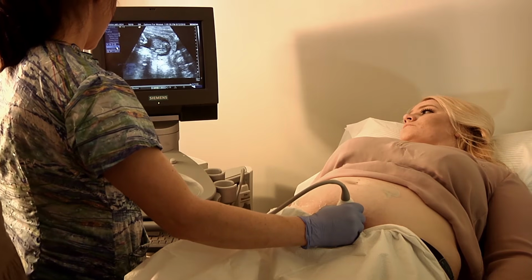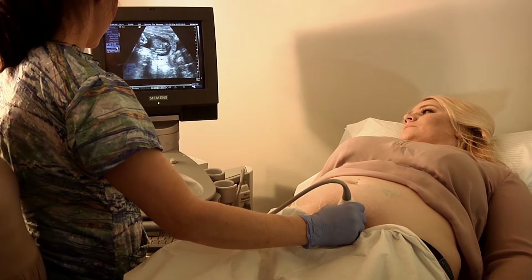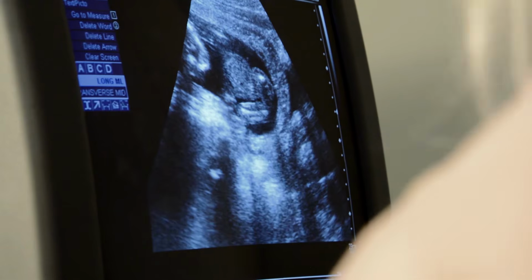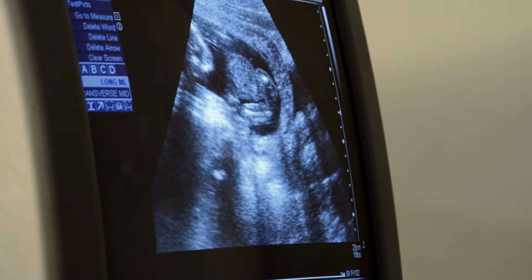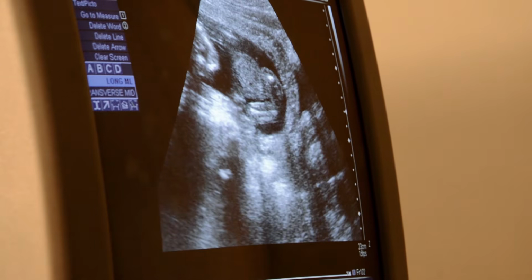midline, lower. You guys, what do you think of her gain? Do you think her gain's good? I think it's good. Well, that's okay. We'll just keep going. So that would be annotation, sag midline, lower. Okay, so go ahead and unfreeze.